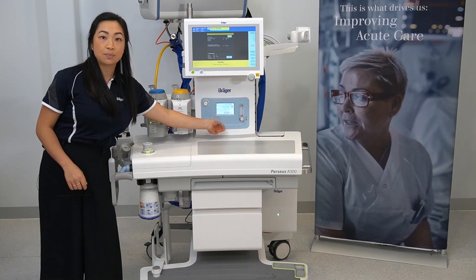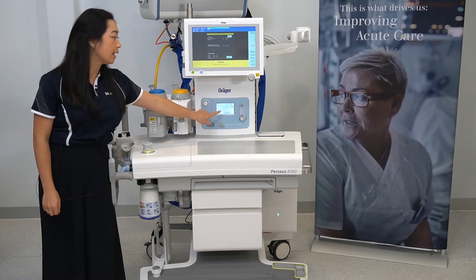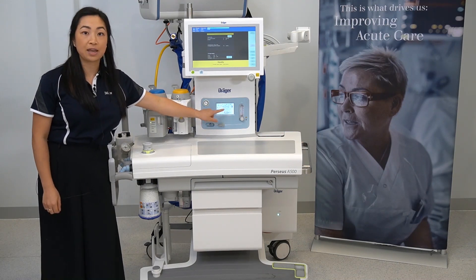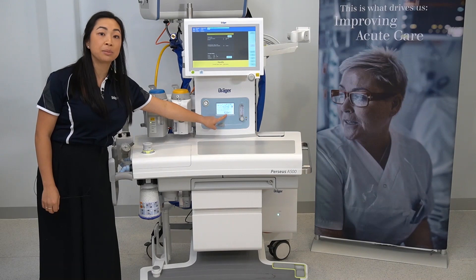This screen will give you information about your power supply and about your central gas and reserve gas cylinder supply. This is your electronic airway pressure gauge, and the time can be viewed here.